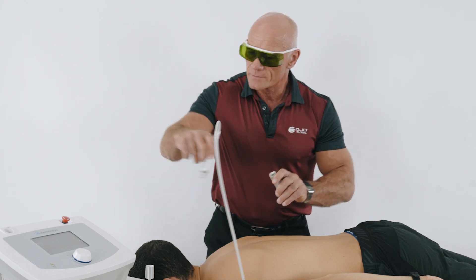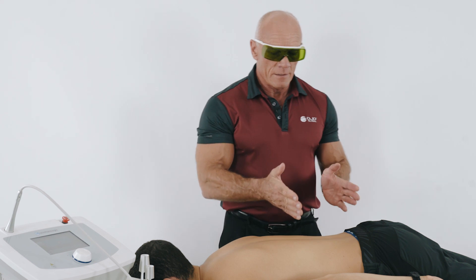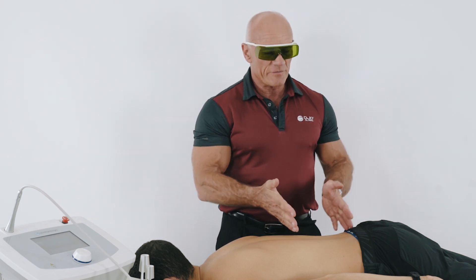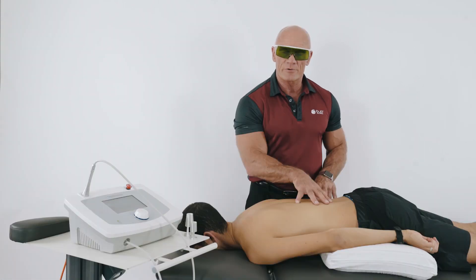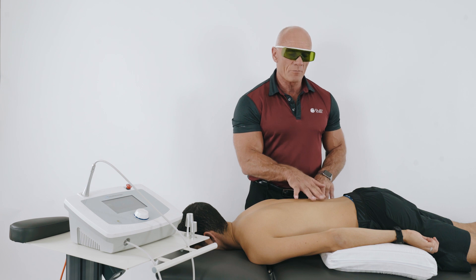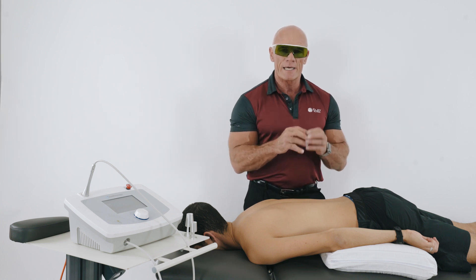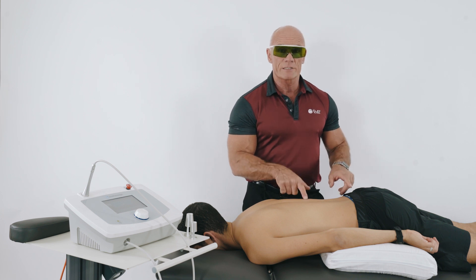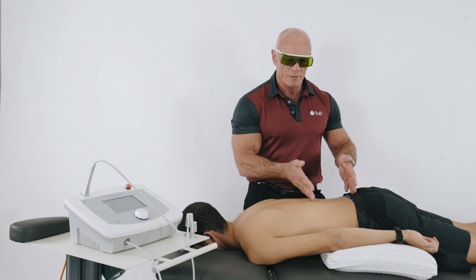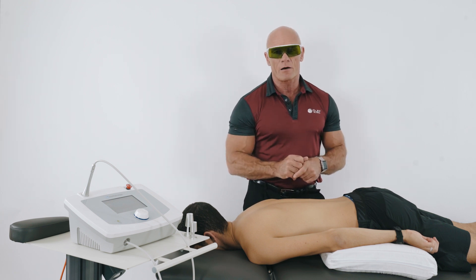When phase three has finished, we've completed our treatment. I would expect at least a 50% improvement in a patient's pain after this first session. In an acute presentation, I'm going to ask this patient to come back and see me three to five times in that first week, using a lower energy dose. If the patient is coming to see me with a chronic condition, then I'm going to ask to see them once a week, but I'm going to use a much higher dosage.